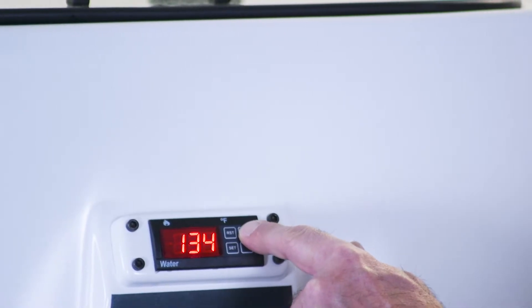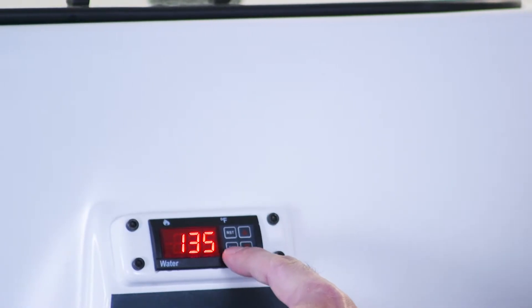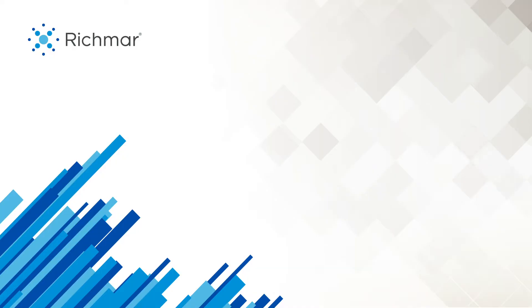You will see the letters HSP. Hit the set button again. It then shows you the current temperature being set for. You hit the up and down arrow keys to set your desired temperature, and then all you have to do is hit the set button again. And that HSP is re-displayed.